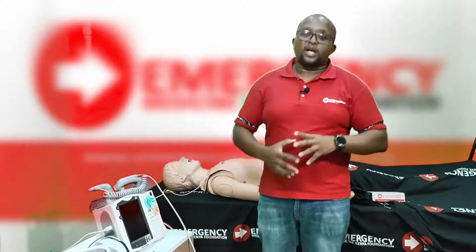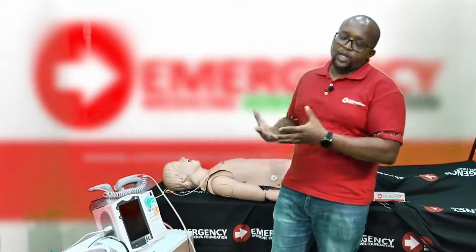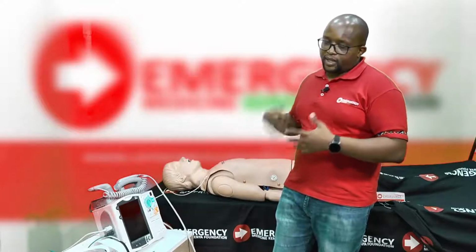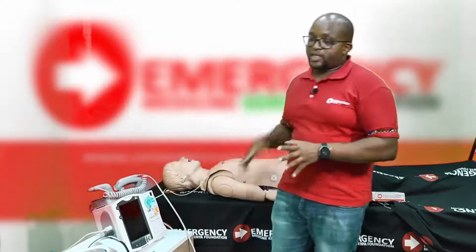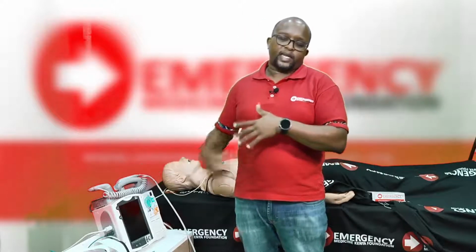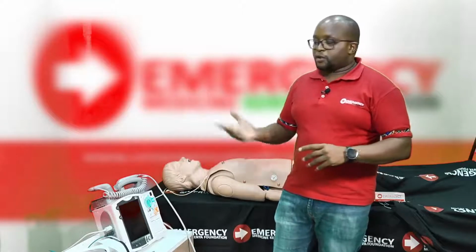And if that doesn't work, consider, is it your technique that is off? Are you using less energy than is required, or your patient has an underlying electrolyte or metabolic problem that's causing the tachycardia that needs to be corrected, and then you can maybe try a third time, and if you've corrected all this and still in, let's say tachycardia above 150, then you need to consider consulting a cardiologist to see what can be done next in terms of therapy.